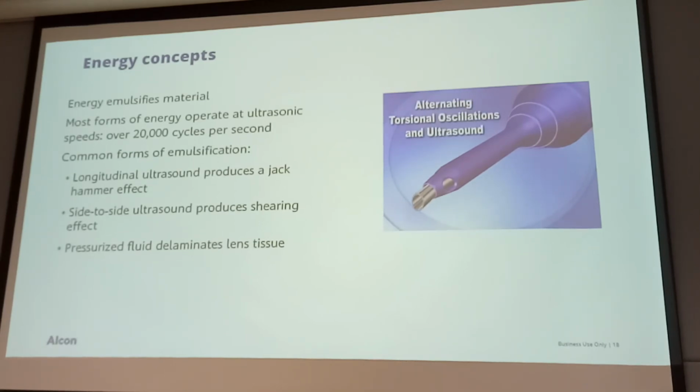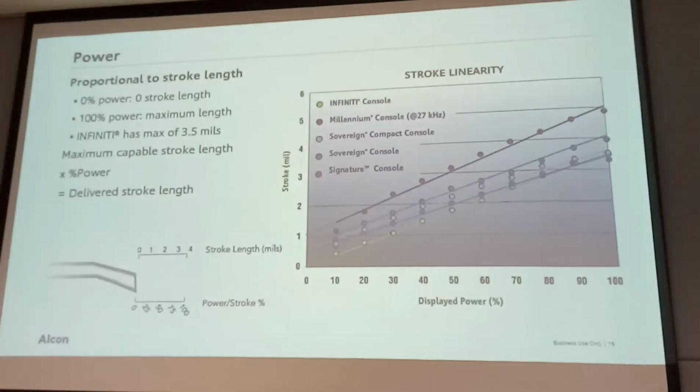Different companies have a little bit different ultrasound handpiece designs. But there are two styles. One style is traditional, the other style is torsional. As we mentioned, traditional has a little bit of push, so that's why Alcon is going to get rid of the traditional in the future: more heat, more push, more parameter setting, more danger. So Alcon insists on torsional, more efficient, two-way cutting, and less parameter setting for safety and efficiency both. Okay, so this is the basic knowledge.